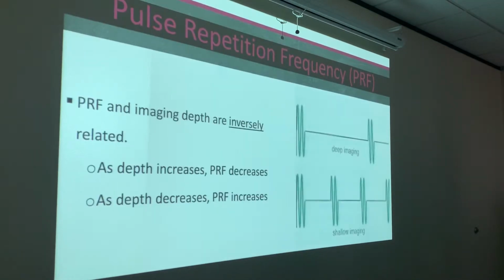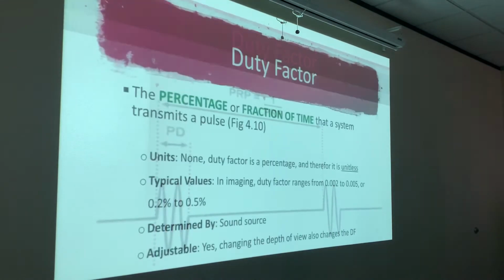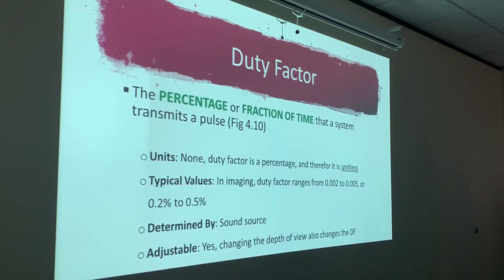Okay, so I want you guys to know that the ultrasound system is always listening a lot longer than it's transmitting. It's always waiting a lot longer than it is sending a signal out. Look at that.